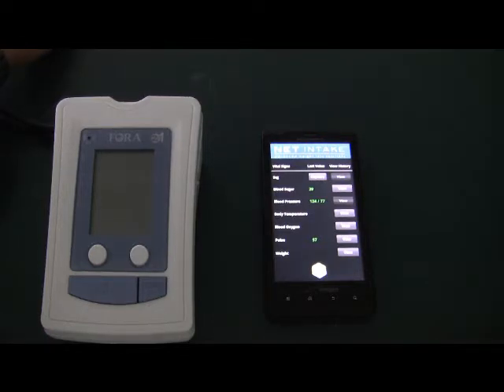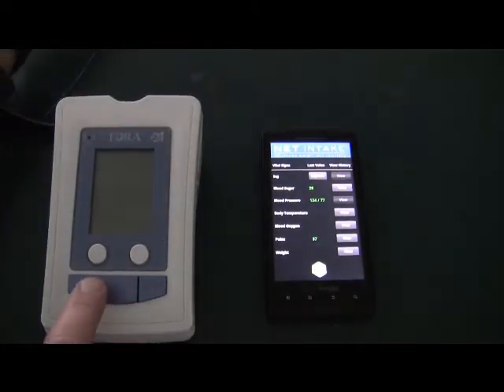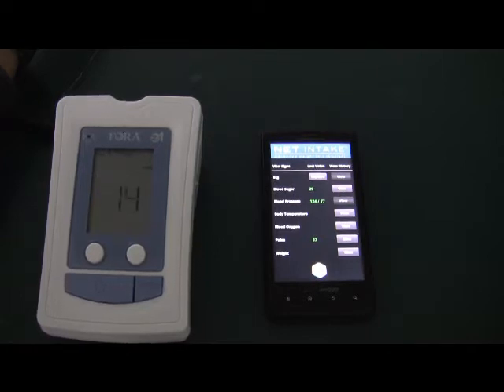Here's the method for capturing blood pressure. Put the blood pressure cuff snugly on the left arm. Lay your hand out flat with the palm up. Press the on button. That will begin the cycle of inflating the cuff. It takes approximately 30 seconds to measure the blood pressure.